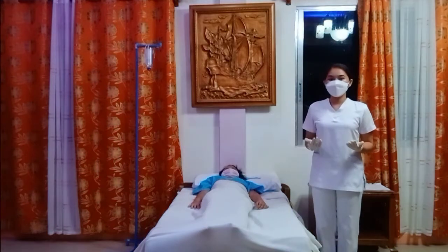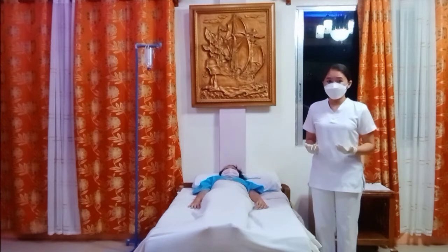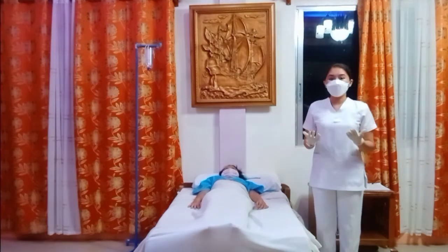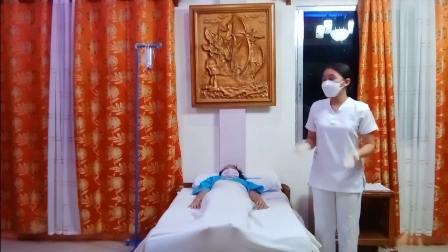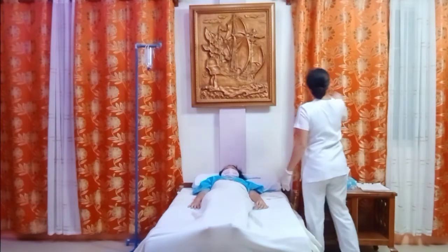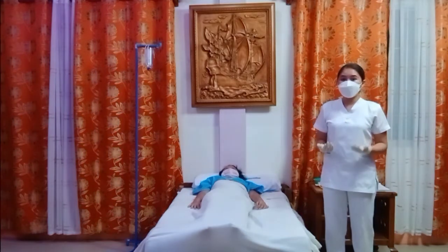Next is to provide for client privacy. If you are in a ward, be sure to place curtain drapes around the area of the bed. If you are in a private room, be sure that the doors are closed and adjust curtains if there are any. Providing privacy is the client's basic right. Through this, we can establish rapport and promote client's comfort and cooperation.